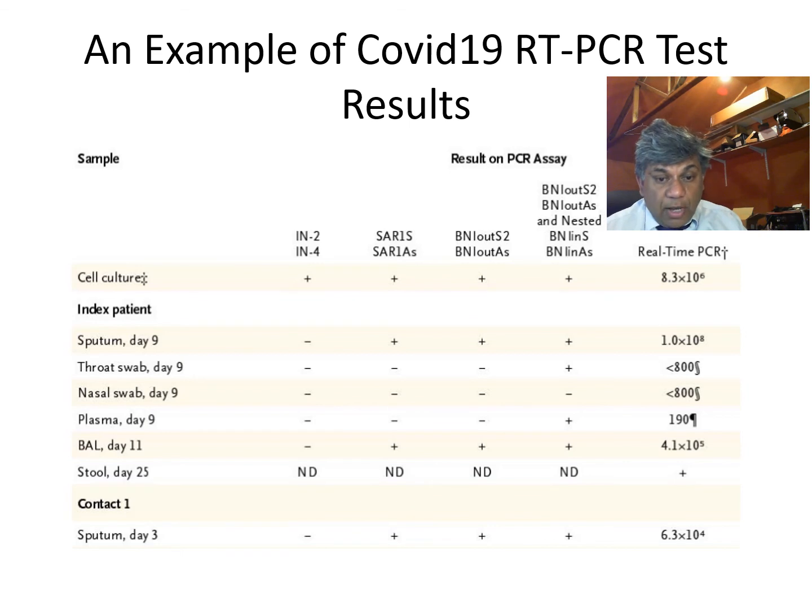This is sputum, which is basically excretions from the cells in your nose. So it doesn't actually have any live cells as such. As a result, it becomes a bit difficult to find out if your sample is truly representative of the infection particles, because it doesn't measure internal virus particles. So this is a bit of a problem in developing a foolproof assay with PCR, but I'm sure in time to come this will become more standardized with new information coming on board.